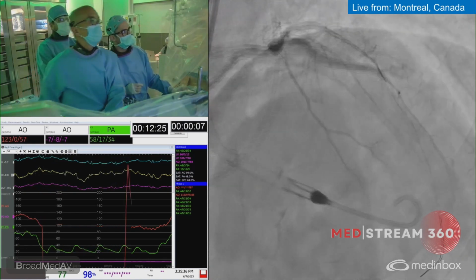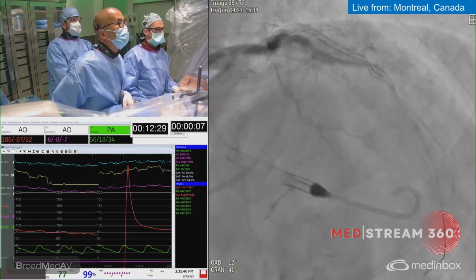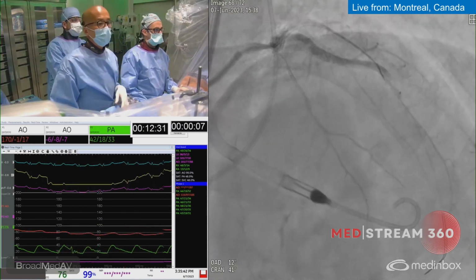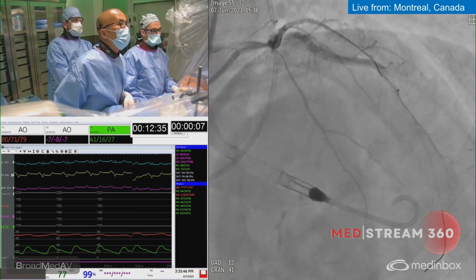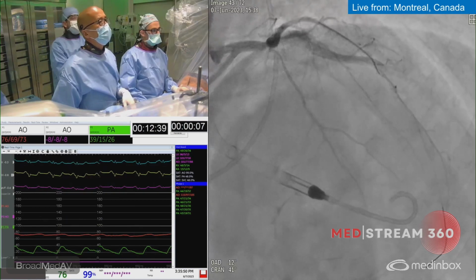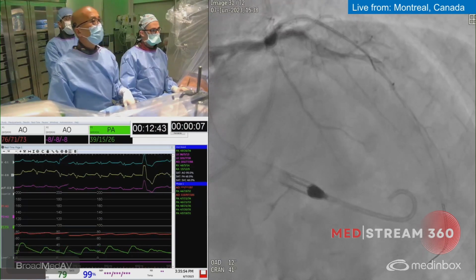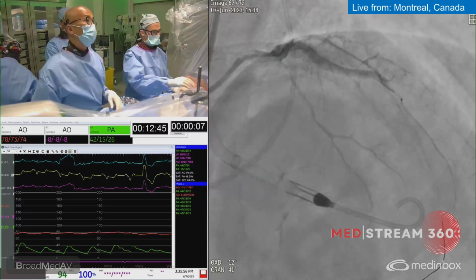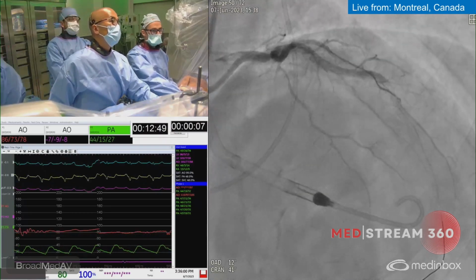Oh, so we have abrupt vessel closure right now. I don't know if it's because of the left main. Again, we're under support. Maybe it's just because of a lot of stents. I don't know if it's the distal LAD or a dissection that's proximal. Okay, so we go with a stent, proximal. We're going to have to recoup this.